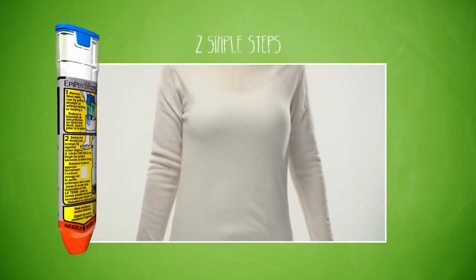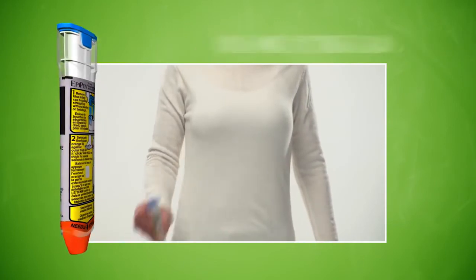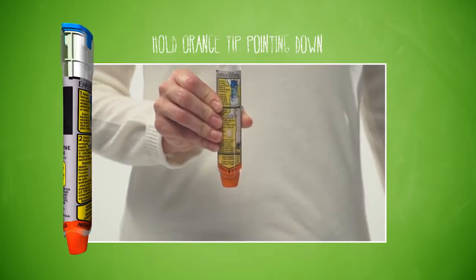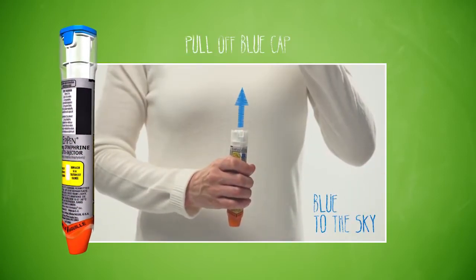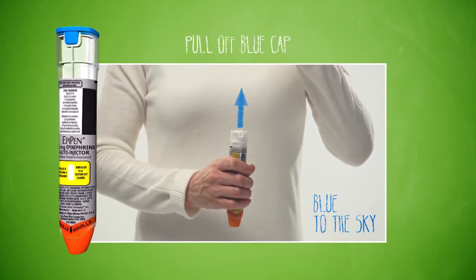EpiPen is administered in two simple steps. Hold EpiPen with the orange tip pointing down. Blue to the sky. Remove the blue safety cap by pulling straight up without bending or twisting it.